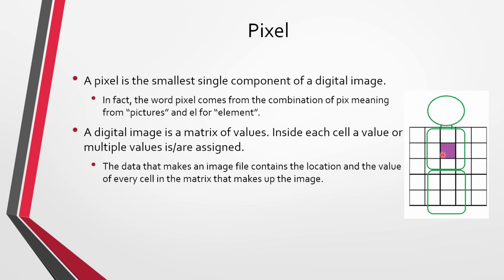And as we've seen here, this is purple. So this is C2 and it's purple. Since purple is a color, we need 3 different values. Red, green, and blue values can make any of the colors that can be utilized. So C2 would be this value that was stored, R123, G73, and B164, this value right here. For all the other cells, if we had different locations and different values, we could create a whole picture from this.